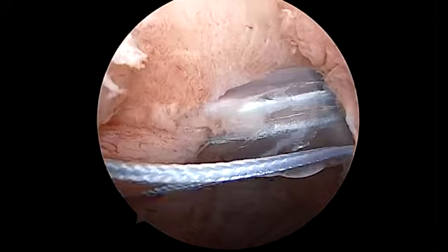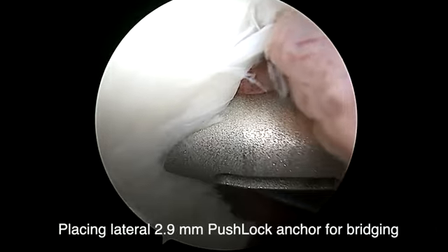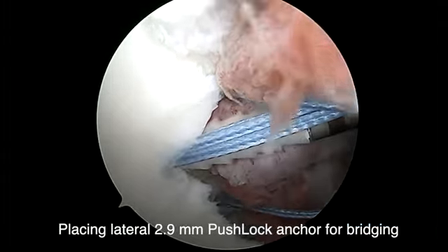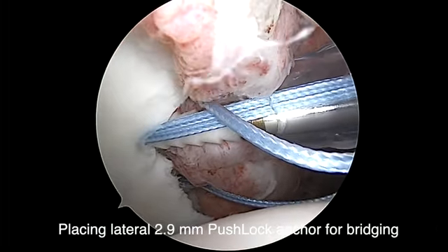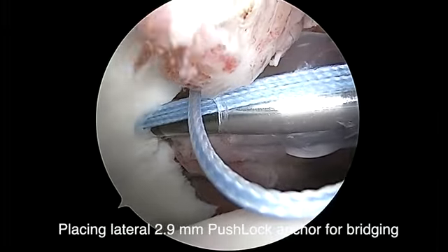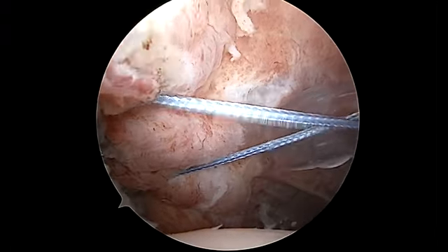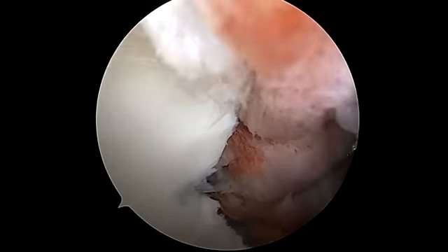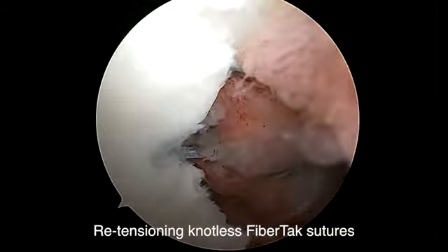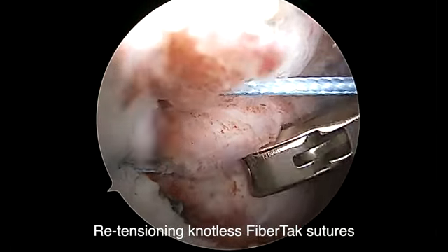The sutures of the suture tack anchor are then placed in a 2.9 push-lock anchor at the articular margin of the glenoid defect between the two fiber tack anchors, creating a compression across the lesion. The sutures are then cut and the two fiber tack repair sutures may be additionally tensioned to provide additional compression. The sutures of the fiber tack anchors are then cut.